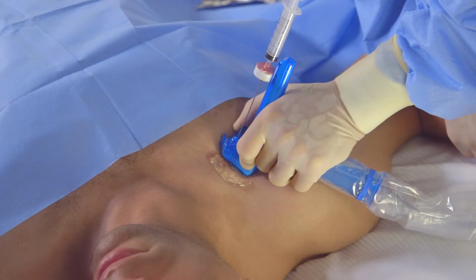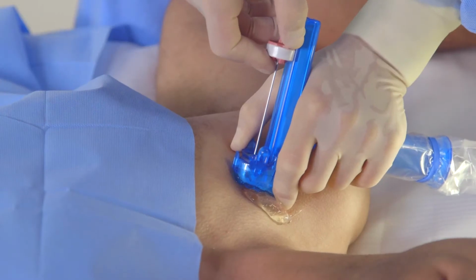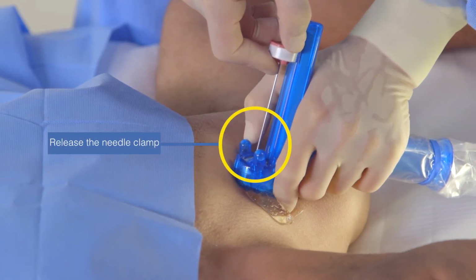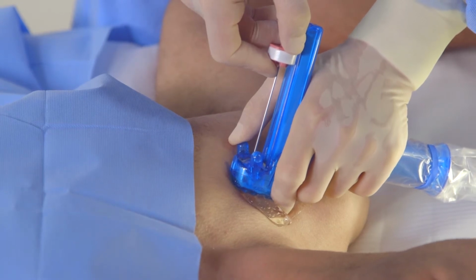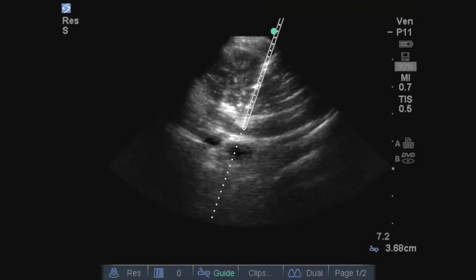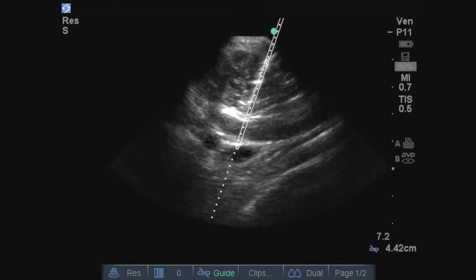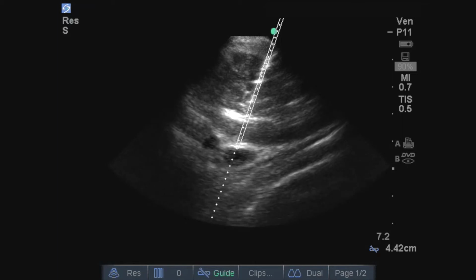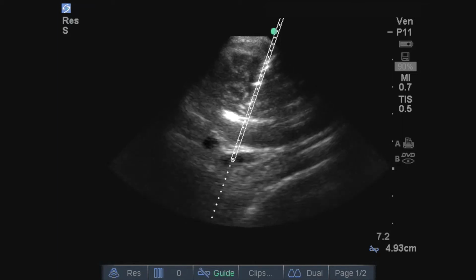Hold the needle assembly and syringe approximately as shown. Then release the needle by rotating the needle clamp fully forward with the thumb to the open position. Advance the needle to the vein while keeping the magnet against the magnet rail. As the anterior wall of the vein deflects under the pressure of the needle tip, slow down and while pulling back on the syringe plunger, gently pierce the vessel. The anterior wall will spring back once it is punctured, which is confirmed by blood flash in the syringe.